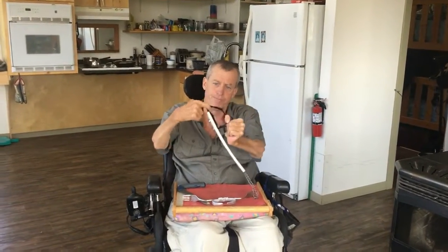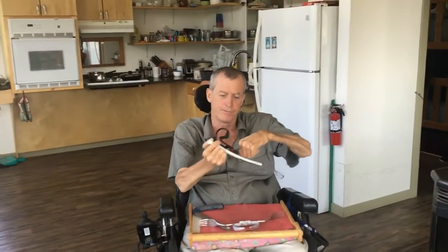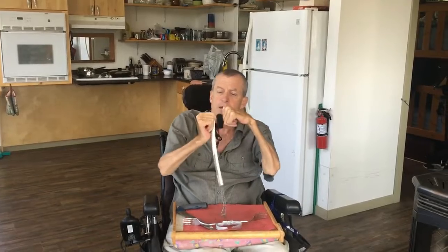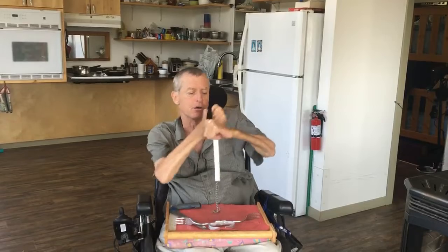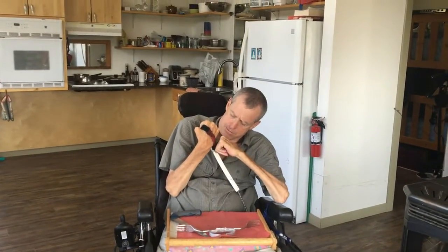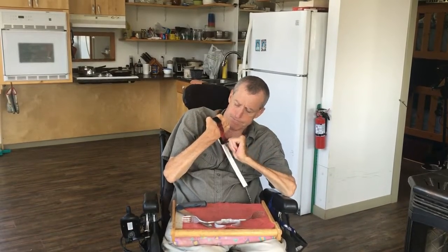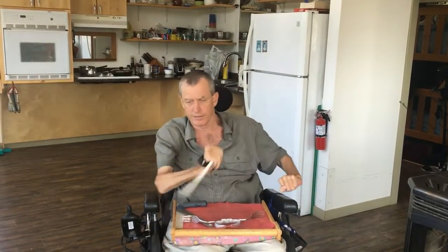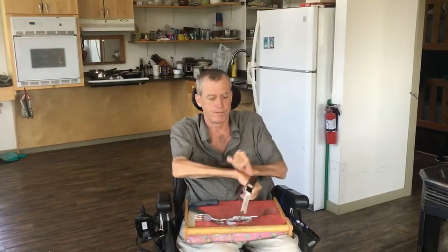These are pretty ubiquitous in the whole OT world, so pretty much anybody knows about it, I think. Then I can just stick this on my hand. I usually just keep it closed. Because of this reason. And it's pretty good just to grab things off that are really close. And the best thing about this one, it's great to get your mail out of the mailbox. You can just kind of get it into the mailbox, hook it around your letters, and pull the letters out.